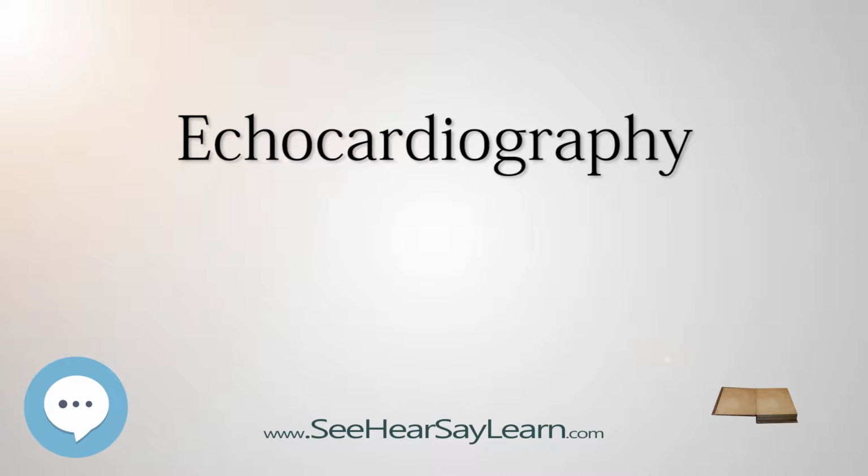An echocardiogram, often referred to as a cardiac echo or simply an echo, is a sonogram of the heart. It is not abbreviated as ECG, because that is an abbreviation for an electrocardiogram. Echocardiography uses standard 2-dimensional, 3-dimensional, and Doppler ultrasound to create images of the heart.